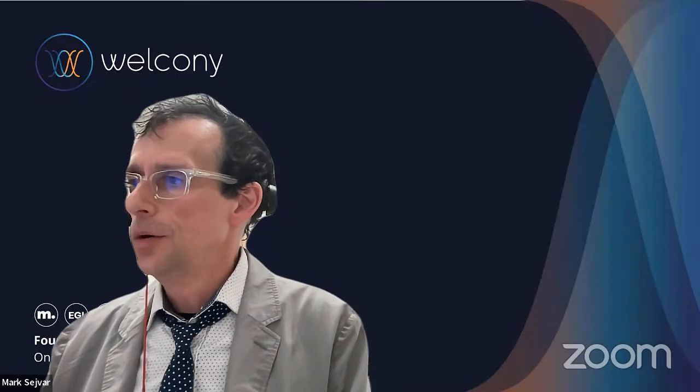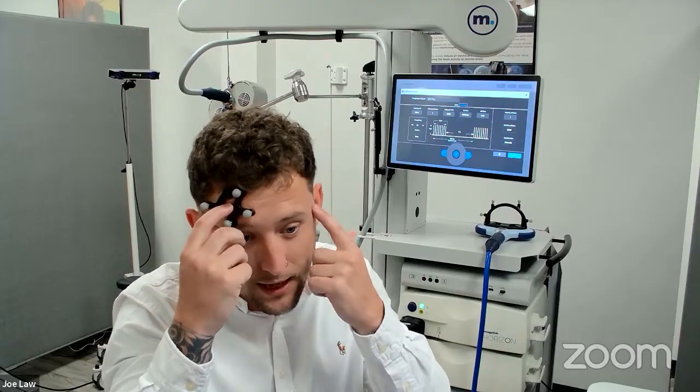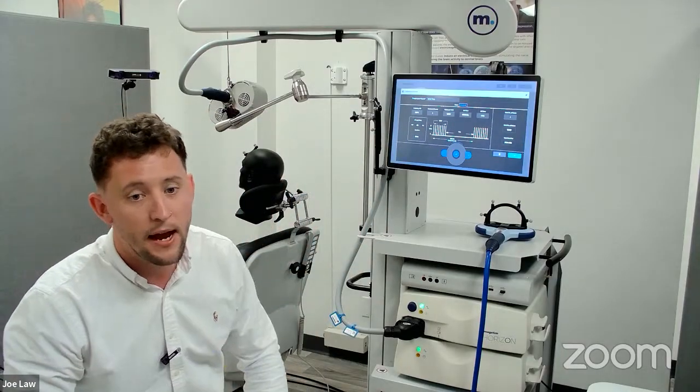Fantastic. Another chair question, Joe. Can patients interchange chairs without having to recheck MTs or input the patient's info into the system? Yeah, great question. The way this head tracker works is it's only looking at where this is in space. So if you've done the anatomical landmarks correctly, you can move the patient in the chair anywhere you want. I generally suggest not doing large movements, just to avoid error. But no, you're fine. If you want to move your patient after doing anatomical landmarks, for example, you can do that.